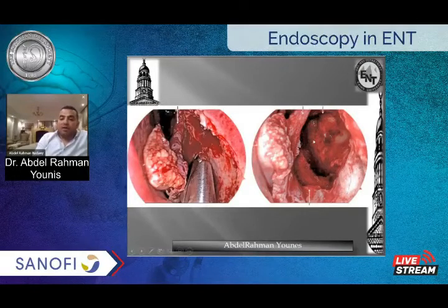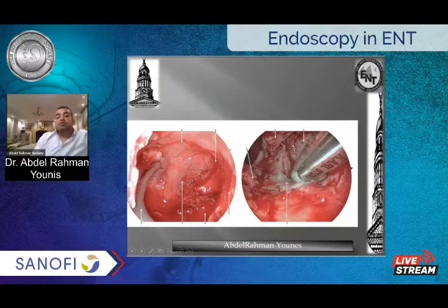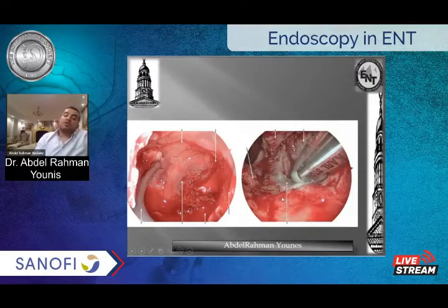Now we're gonna have a wide window exposing most of the maxillary sinus. If we introduce a curved cannula here, this is the roof of the maxillary sinus, this is the anterior wall of the maxillary sinus, this is the alveolar margin, this is the posterior wall of the maxillary sinus. It's an excellent maneuver to have a complete panoramic view of the maxillary sinus. Don't forget, the bony ridge between the floor of the nose and the maxillary sinus should be drilled out to avoid any consequent osteomyelitis, and when you return back your flap, try to cover such a bone.